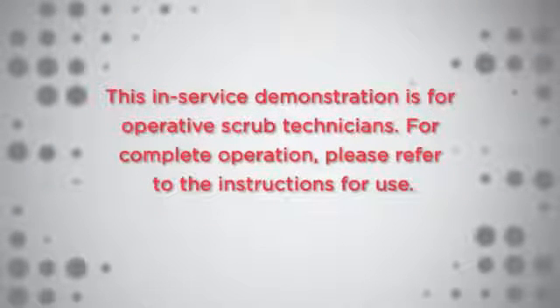This in-service demonstration is for operative scrub technicians. For complete operation, please refer to the instructions for use.